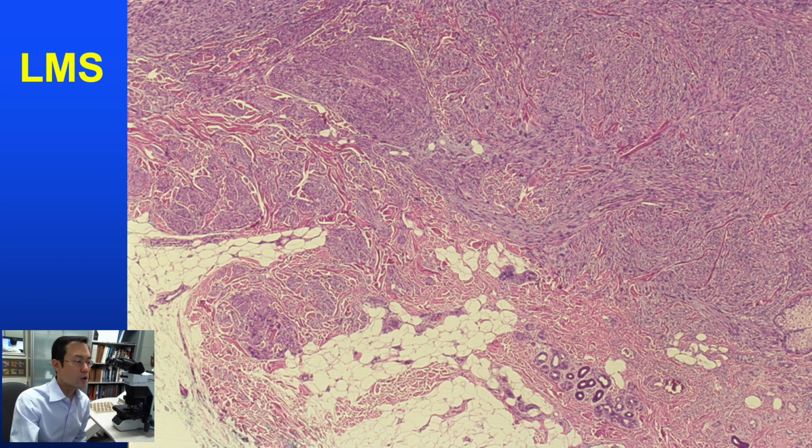In leiomyosarcoma, we have very compact, irregular fascicles of atypical spindle cells, a little bit more of an infiltrative pattern of growth in many areas, such as the periphery of the tumor here. And even from medium magnification, I can make out these large basophilic aggregates, some or all of which surely correspond to large atypical nuclei and/or mitoses.